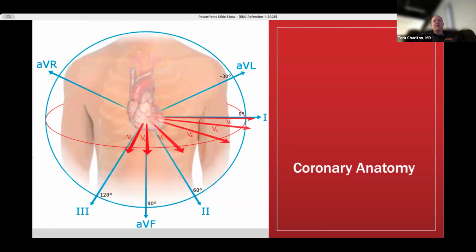So when we talk about an EKG, it is simply measuring electrical activity, all right? We've got various lead placements, and we have the ability to divide the heart both front to back as well as top to bottom, all right? And that's where those two discs that you see there are. The important thing to remember about every EKG is whenever there is an upward spike on the EKG, that is electricity flowing towards that lead. If electricity flows away from that lead, that causes a negative spike, okay?